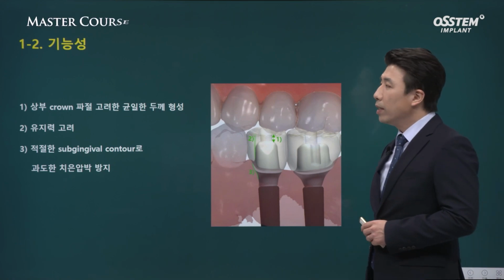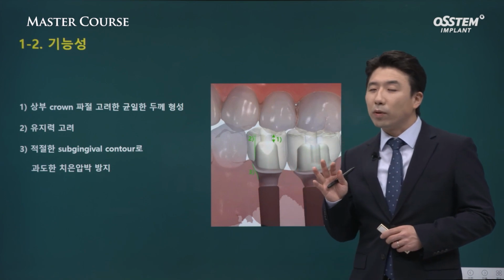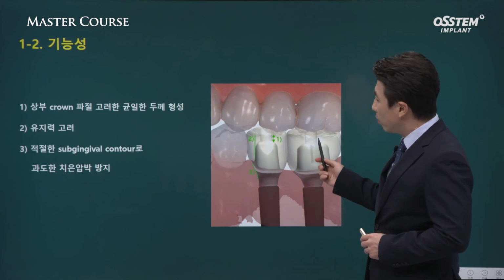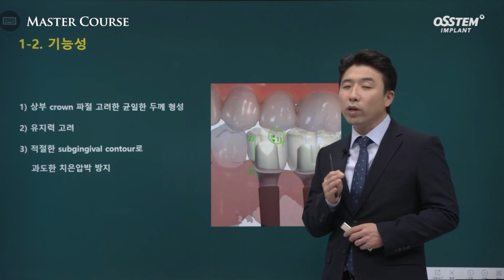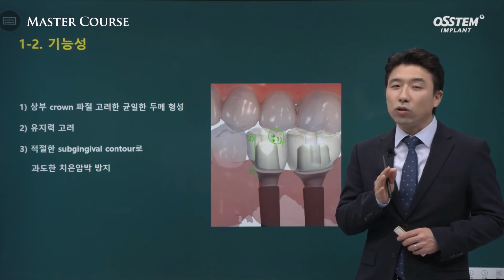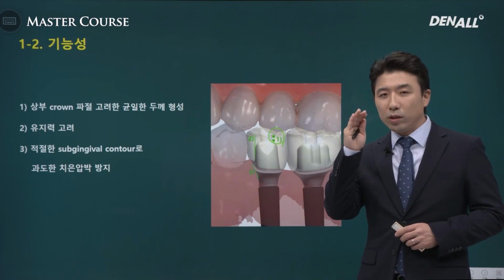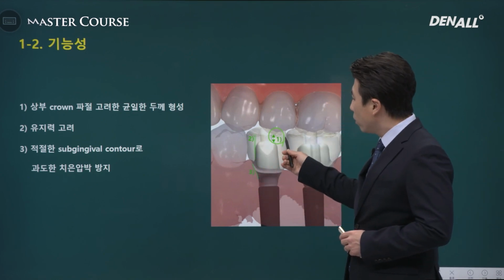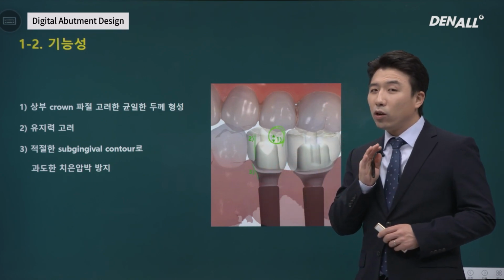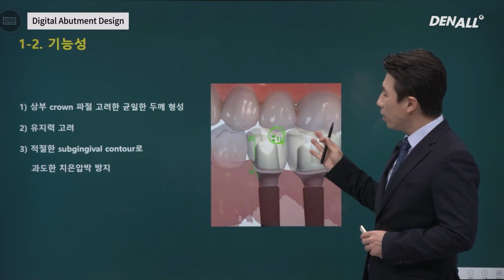This is a step before providing prosthesis. The importance of abutment shape is underscored, and considerations for the crown thickness at the abutment level are fundamental. The appropriate thickness for different materials varies depending on whether it's gold, zirconia, or PFM, and how much distance you're going to have with the antagonist. Things can vary. Such considerations need to be made.